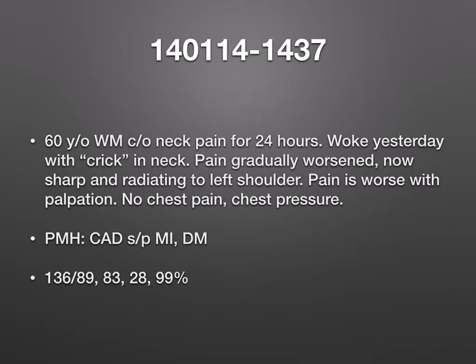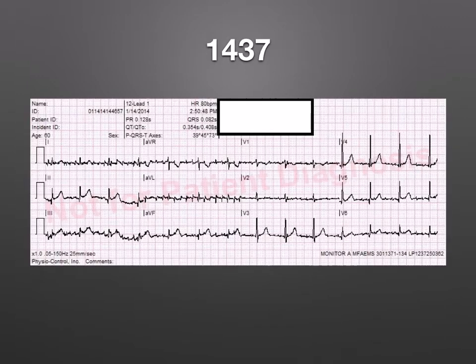We specifically documented that he has no chest pain and no chest pressure. He does, however, have a past medical history of coronary artery disease, and he's had an MI in the past. He also has diabetes. Those are his vital signs, and here's his ECG.